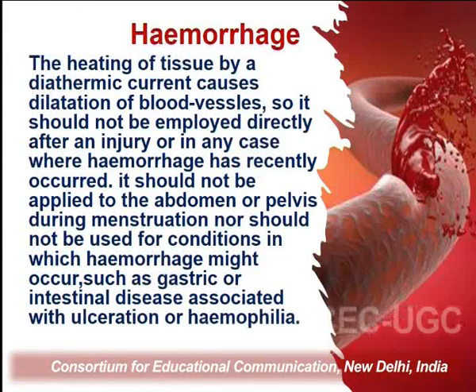It should not be applied to the abdomen or pelvis during menstruation, nor should it be used for conditions in which hemorrhage might occur, such as gastric or intestinal diseases associated with ulceration, or hemophilia.